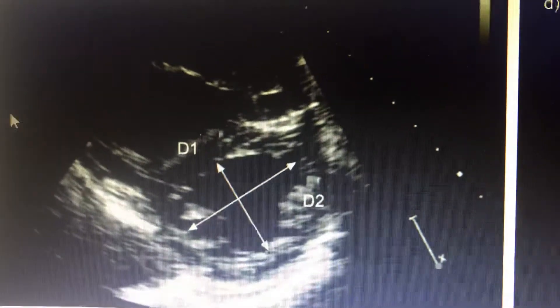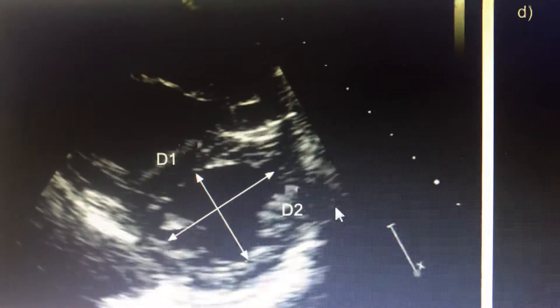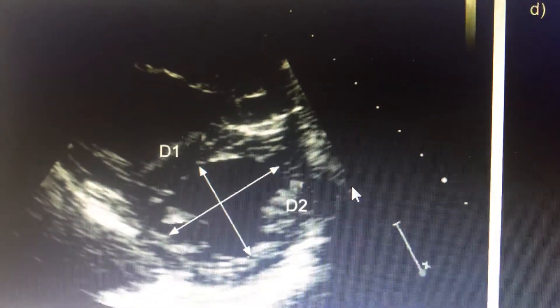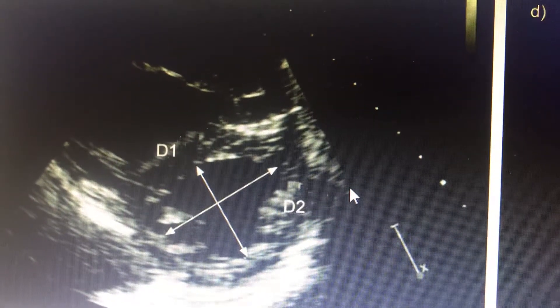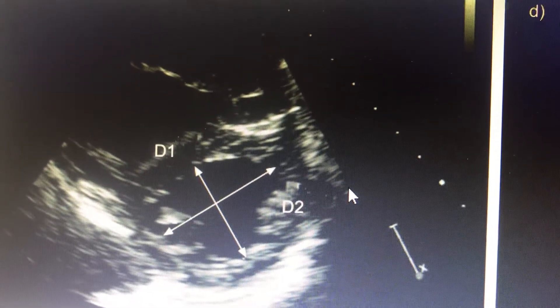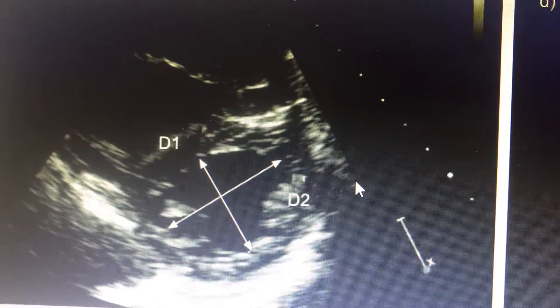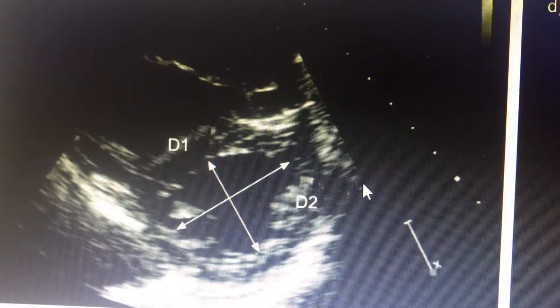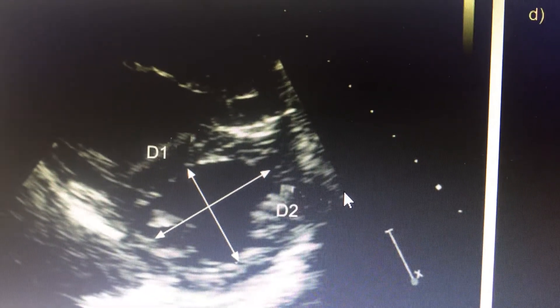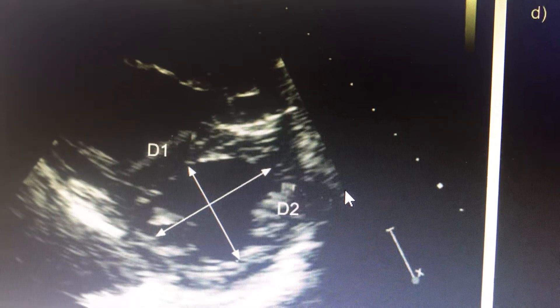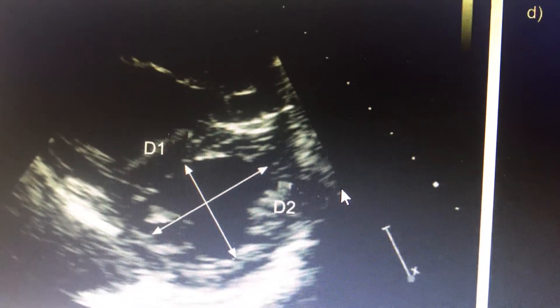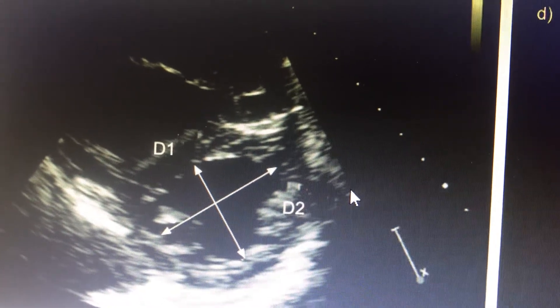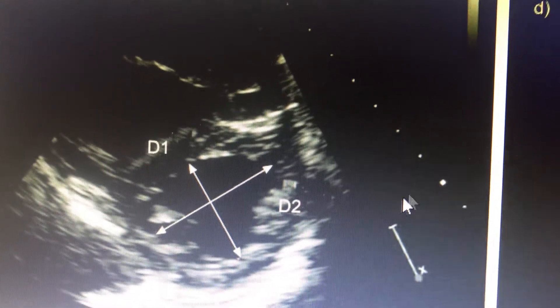We will discuss the LV Eccentricity Index. The LV Eccentricity Index is an index of how eccentric the LV is becoming, used for assessment of ventricular hypertrophy and dilatation in pulmonary artery pathologies or other pathologies which affect the RV.